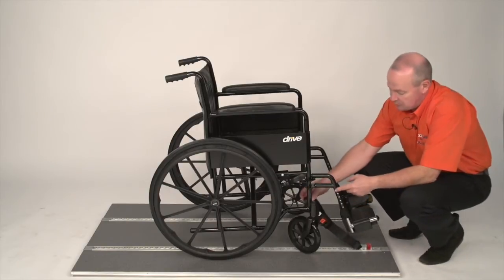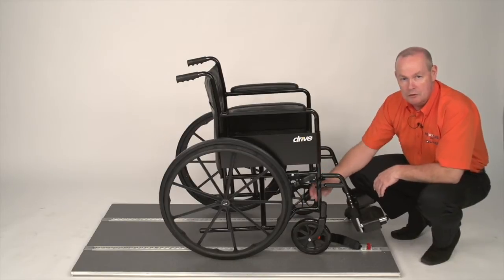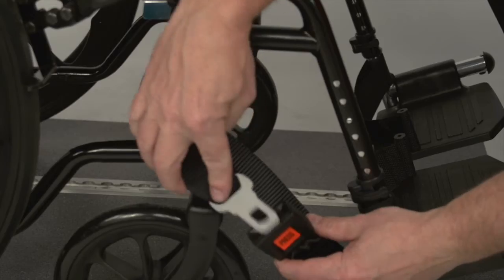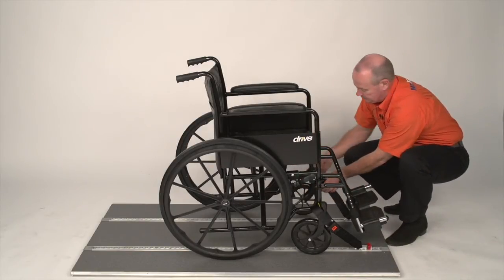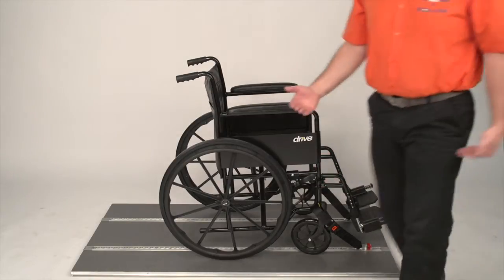We then have to secure the strap onto the wheelchair onto what we call the mainframe. The mainframe is where the horizontal and vertical bar meet. The strap will be undone, coming from inside to out, tongue back into the buckle. Do the same for the other side — again inside to out, around, back into the buckle. The front straps are non-adjustable, so we have to put tension on.